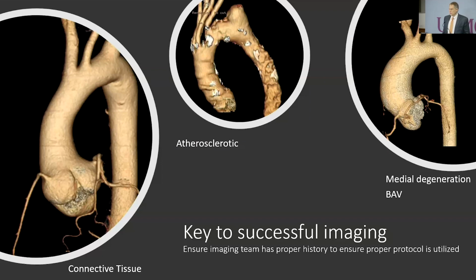And really, one of the keys to successful imaging is to make sure that the imaging team is actually aware of what the plan is and what the thought process is clinically. We put a tremendous amount of effort in our area into lab techs, 3D lab techs, and they actually go out and look at every single case.